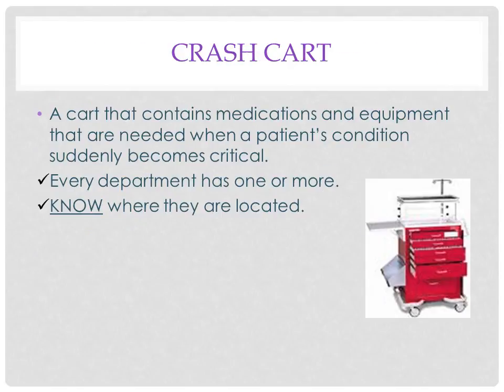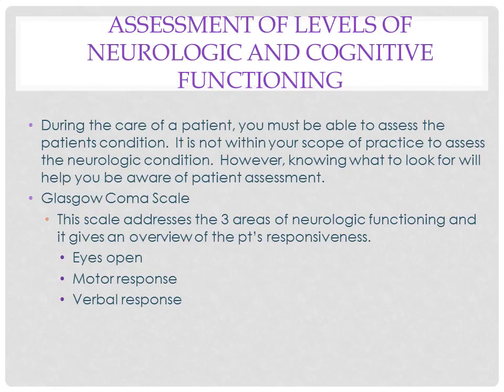A crash cart is a cart that contains medications and equipment that are needed when a patient's condition suddenly becomes critical. Every department has one or more. Know where they are located.